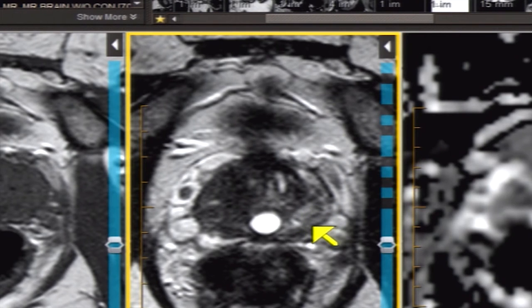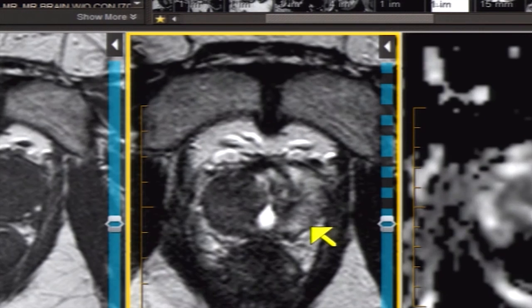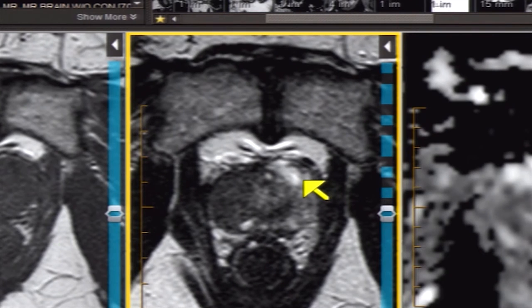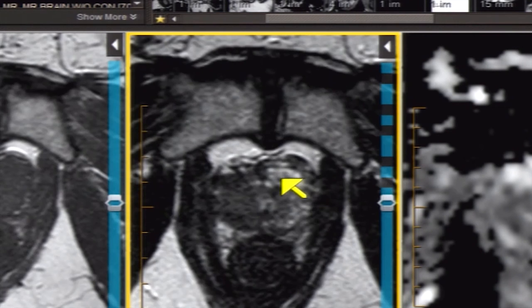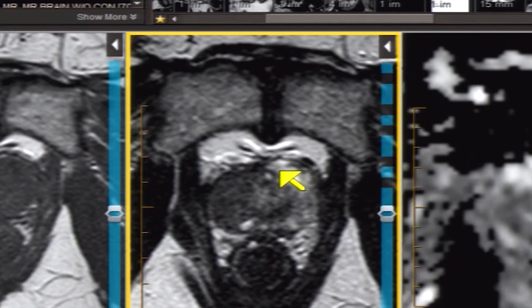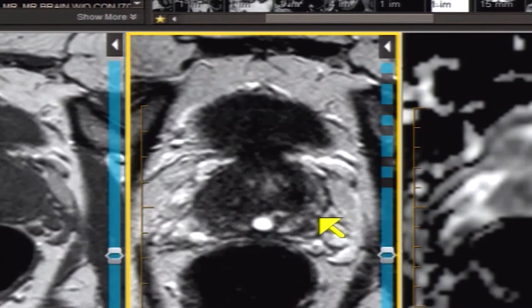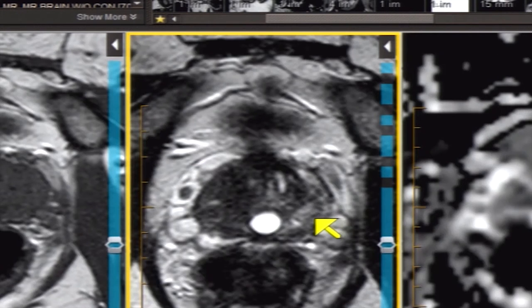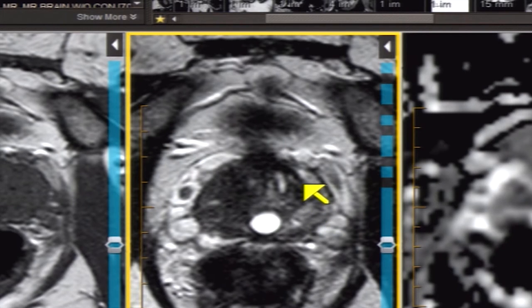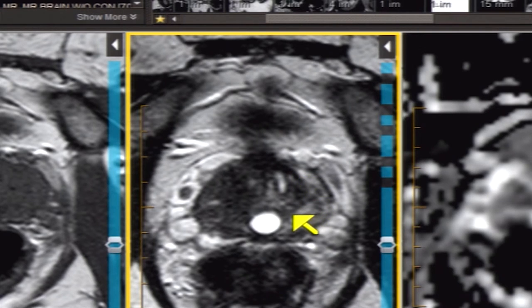The outer portion of the prostate — let's scroll from top to bottom — goes all the way down to the bottom of the prostate. This portion of the prostate that is more hyperintense and curvilinear is known as the peripheral zone. The demarcation between the central region and the peripheral zone is known as the surgical capsule.